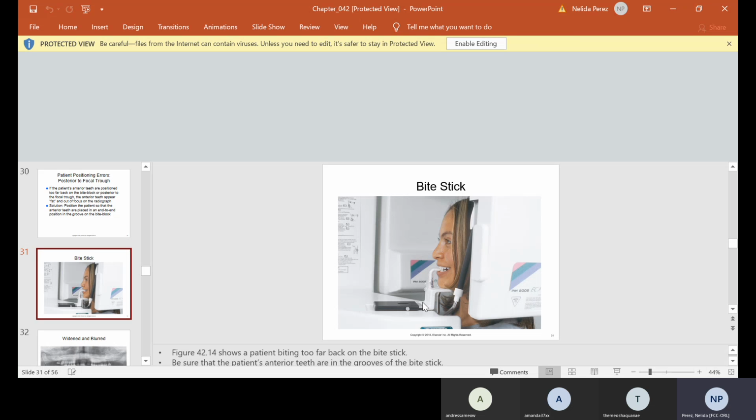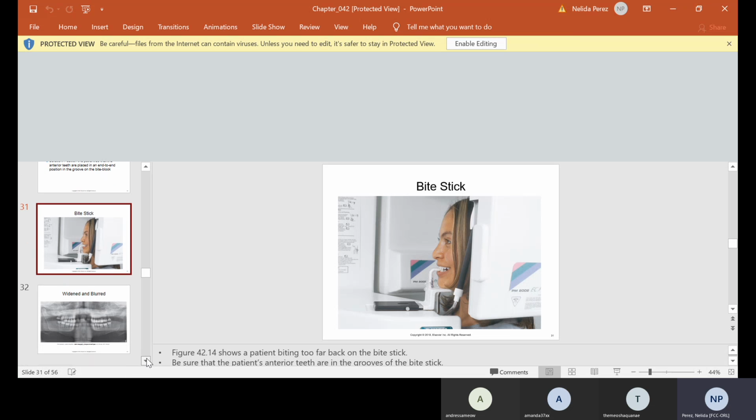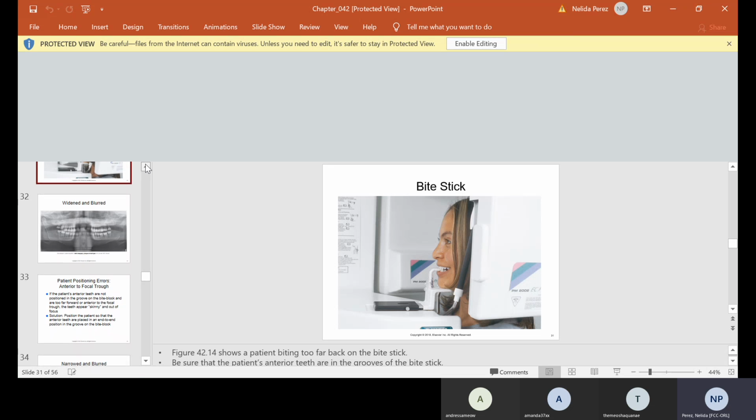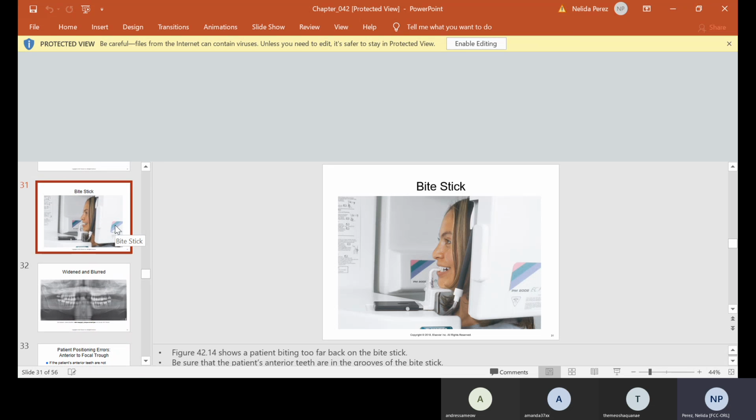Now, here's another tip to let you know whether the chin is too high or too low. There is a button, and we probably will be coming to it, and if not, when you come into lab, I will show you what I mean. There's a button that you press, and it will make an X on the patient's face. And that kind of tells you if you're aligned.